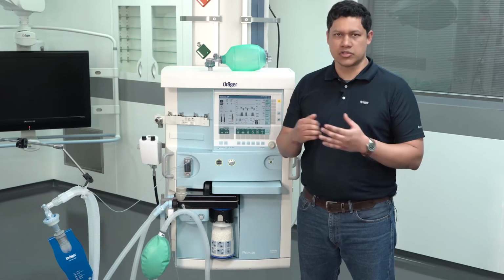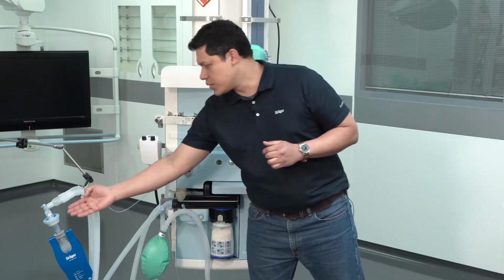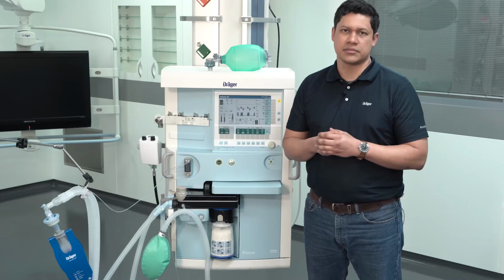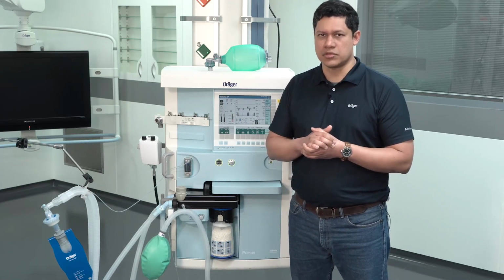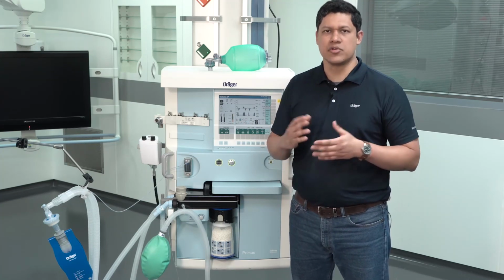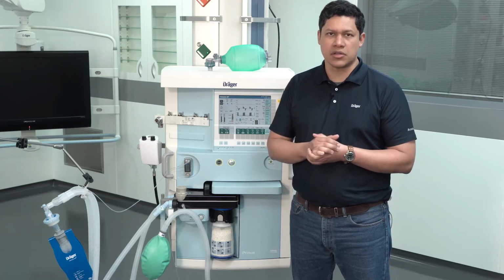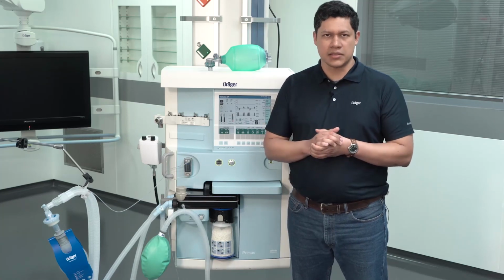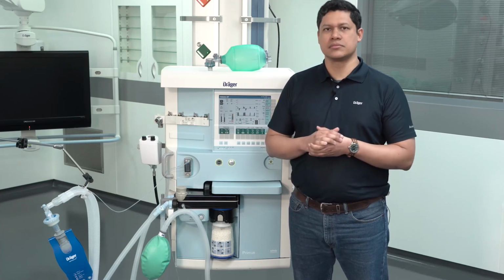Keep in mind that you also have to regularly verify the patient filter. You have to look for humidity or a blocked filter. In that case, you have to exchange it. Please remember, only mechanical filters should be used, if possible in combination with passive humidification by using a filter with HME, as close as possible to the patient in the system. Keep in mind, the hospital guidelines should always be followed with regard to infection prevention.